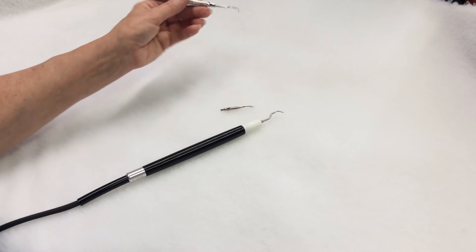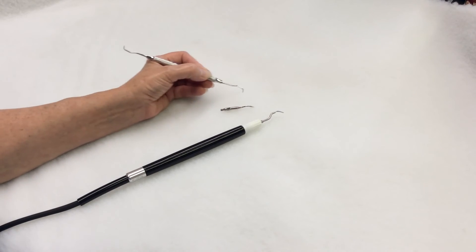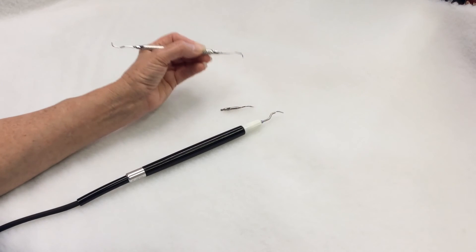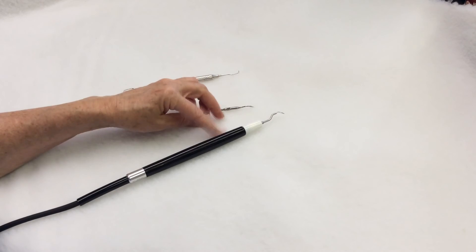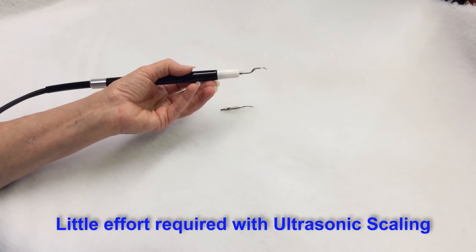When you use a regular manual hand scaler you need to apply pressure very close to the gum line as you scrape the tartar off. Not so with an ultrasonic scaling device. This is why it was invented, so you don't have to work too hard.